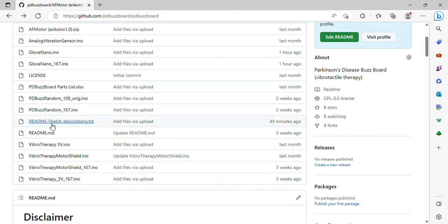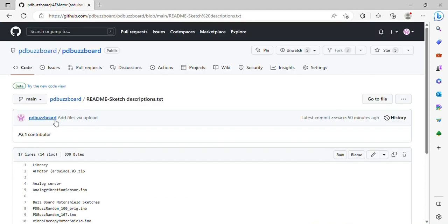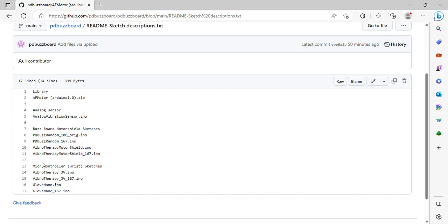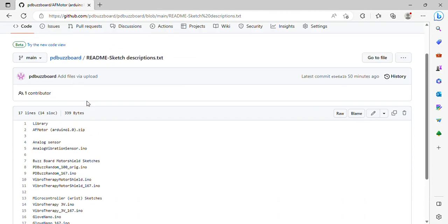One addition is I put sketch descriptions up — I'll build them out better later, but wanted to get something up. It was a very good suggestion to at least put something up there that describes what they are. These are the sketches that go with the motor shield, these are for the microcontroller. The Glove Nano and Nano 167 are new ones. Thank you to Michael — he's the one that wrote the buzz board random and also wrote the Glove Nano random. I also have the motor shield library listed here.